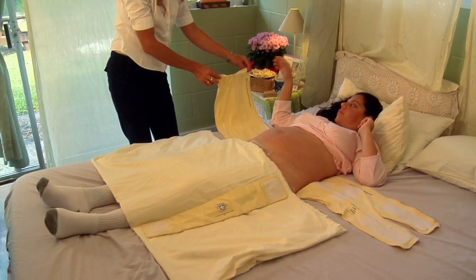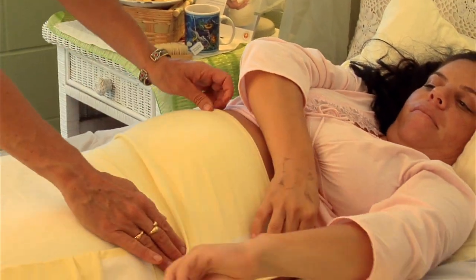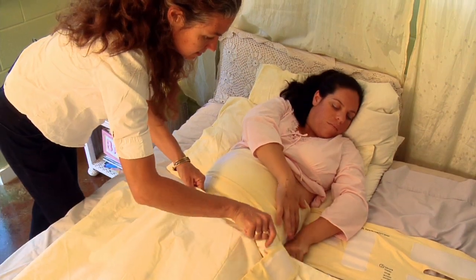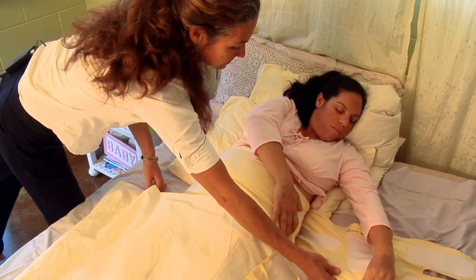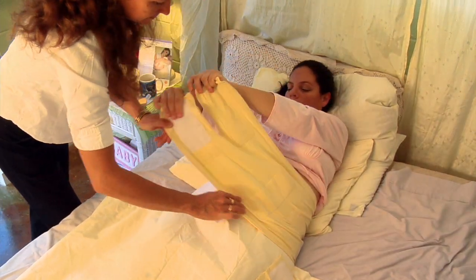Put it over the side. We're going to make sure that it covers your incision. Always make sure that the belt is at least one inch below the incision.